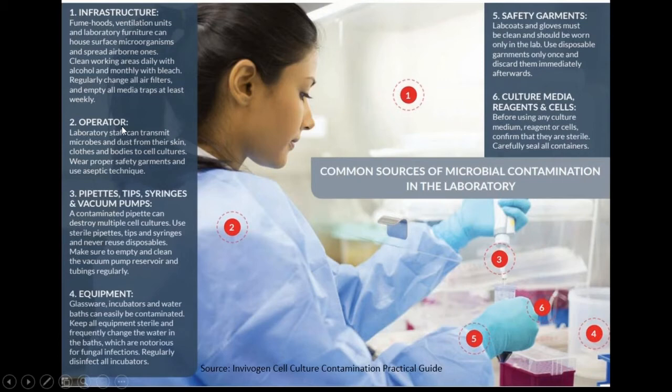Operators are the laboratory staff. Every time you are doing cell culture work, make sure you are wearing the proper PPE and practicing good aseptic technique. Pipettes, tips, syringes, as well as vacuum pumps, can also be a cause of contamination. Equipment, safety garments, culture media, reagents, and cells could also be common sources of microbial contamination in your lab.